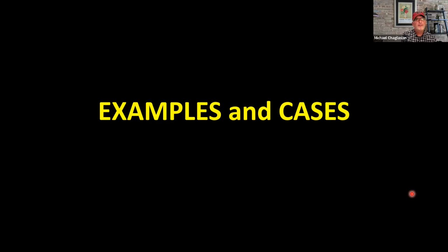I guess I should mention the one question I always get, and I meant to, hopefully the section helped to answer it, but I perhaps did not answer it directly, which is, what do I do with my 8, 9, 10 diopter myope who I think has glaucoma? They still want to know what to do, and it's a fair question. I tried to point out that the OCT is not going to help, and I would just try to reiterate that, be cautious.